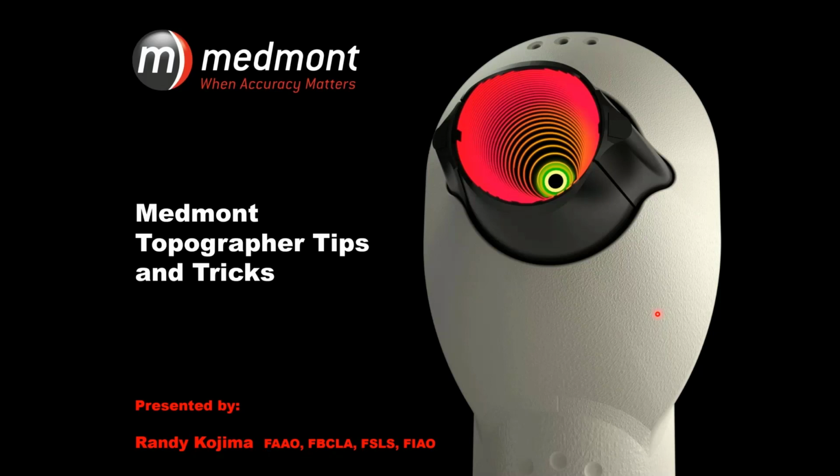Hey, thanks, Chris. And thanks everybody for logging in. So welcome to this session on the Medmont Topographer, called Medmont Topographer Tips and Tricks. And the goal today is to really talk about some non-standard applications of the Medmont that maybe you haven't been introduced to. So we'll go through a whole series, and we hope that there'll be at least a few that you'll be able to add and implement into your practice. My name is Randy Kojima.